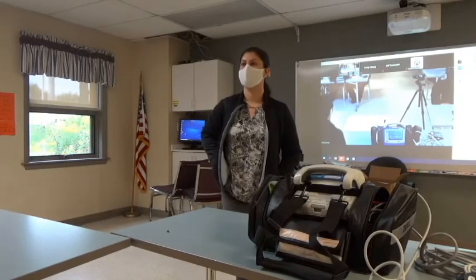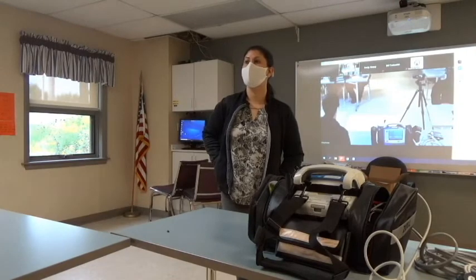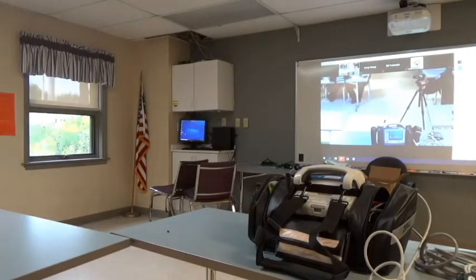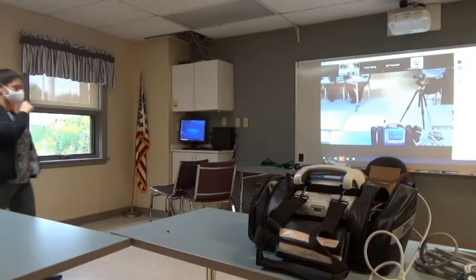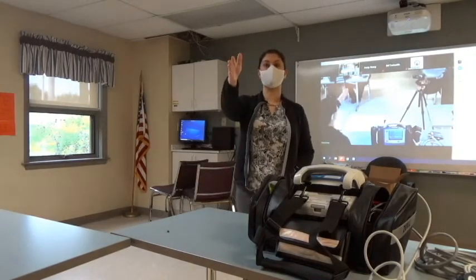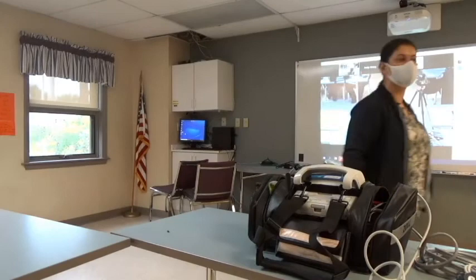Our default in protocol is starting at 80. Oh, okay, that's right, I forgot. So it might have to go up just a little bit. Sorry about that, I forgot. You'll get a blue pacer spike in front of every green QRS.